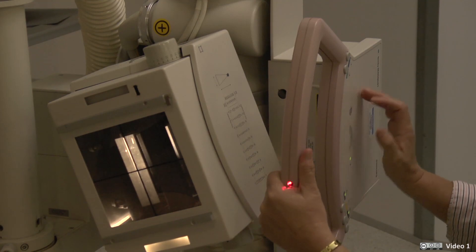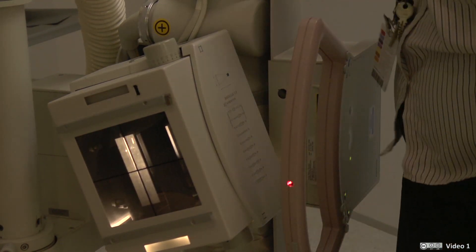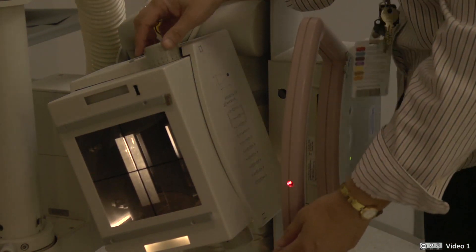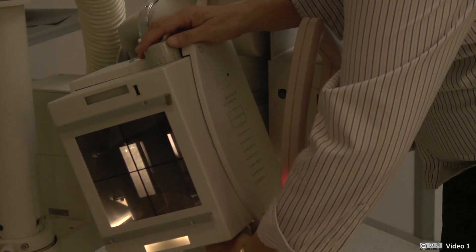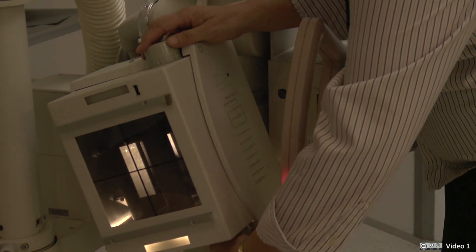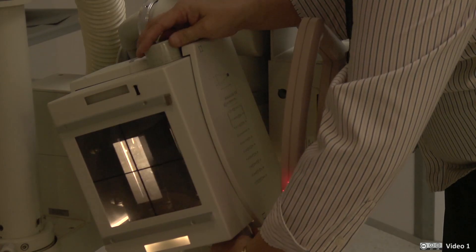Below the x-ray tube, but still within this unit, is the light beam diaphragm — the LBD — which is used for collimation. Let us now look at how the radiographer will use the light beam diaphragm to collimate, or restrict, the x-ray beam to the desired region.